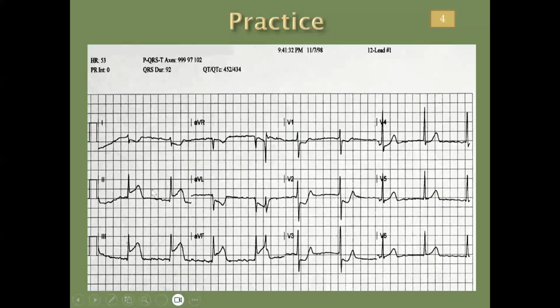All right, if you look over here, then we've got 2, 3, and aVF. One of the ways that I remember those is it's low and it's inferior low. All of these have positive electrodes down here, and they look up at the inferior wall of the left ventricle. And if you look over here, you can see the ST segment depression, and those are the reciprocal changes that I've been talking about that occur early when somebody is having an MI.